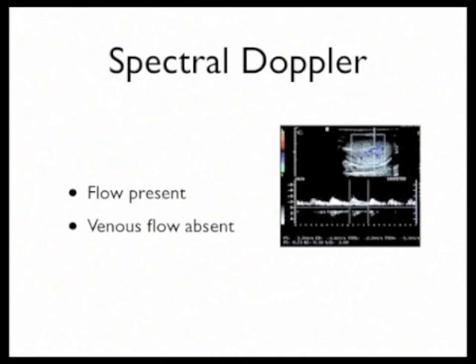Hello everybody, welcome back to Testicle Month here at the Ultrasound Podcast. Now, last episode we ended by showing you how to actually scan the testicle, the acute scrotum, and we're going to start off this time by showing you that clip again. Then we're going to jump right in and talk about this spectral Doppler stuff, and we're going to give you some concrete examples of how you can actually use this in your clinical practice to make a difference on your next shift. Well, maybe not your next shift, but the next shift where you see someone with a painful swollen testicle. So, roll the footage.